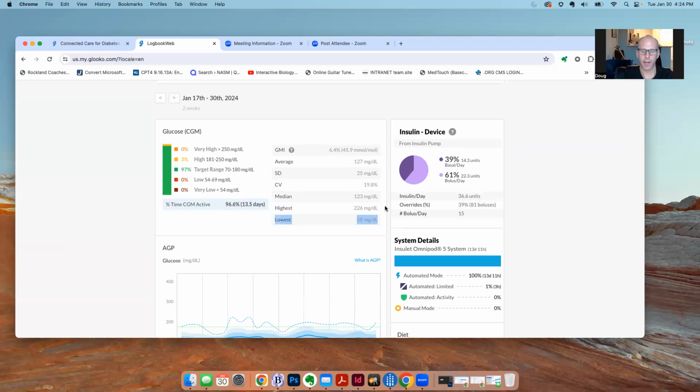As an example, there's many times that I walk into a workout class with like 0.5 active units on board. And because of the way that I'm spiking my blood sugar and it's seeing that number increase despite the exercise, which it doesn't know I'm doing, I could walk out of the class with 2 units on board because it's really trying to correct me aggressively. And so you think about it, you've got 2 units on board, plus you've exercised. It's pretty natural that you're going to come down very fast. So if anybody's struggling with this, either correct after the workout, take more sugar if you are starting to tank, or consider trying to use activity mode and don't just leave it in automated like I do. But it is working.